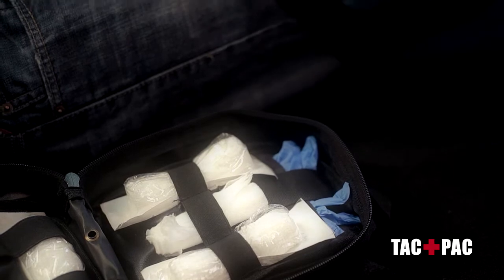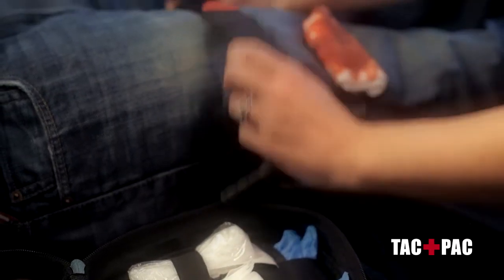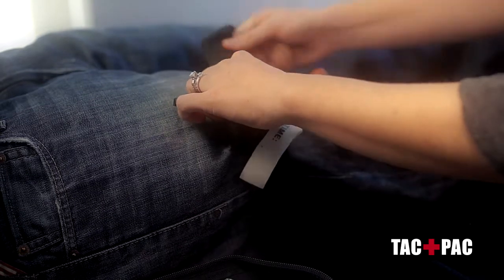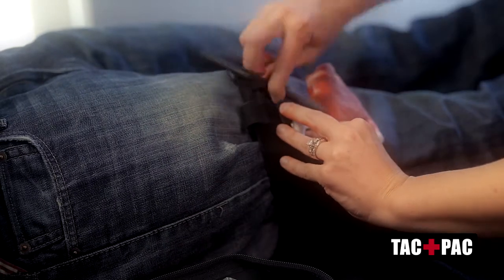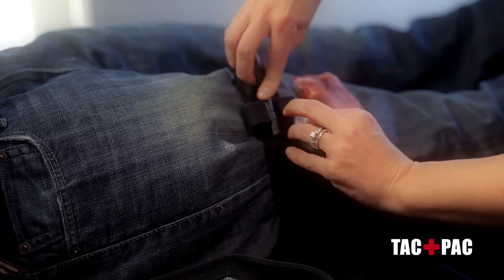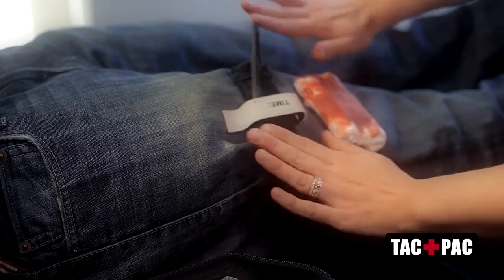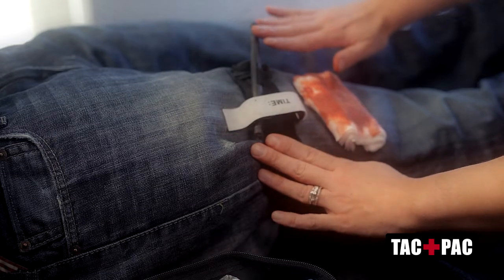For an injury to the leg, you slide the tourniquet above the wound, pull on the red tab, tighten it down snugly, turn the windlass, lock it into place, and cover. When the windlass is locked into place, all bleeding should have stopped.